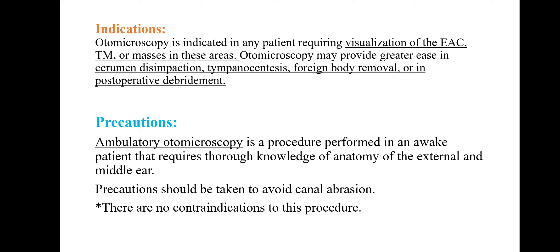Precautions: Ambulatory otomicroscopy is a procedure performed in awake patients that requires thorough knowledge of anatomy of the external and middle ear. Precautions should be taken to avoid canal abrasion. There are no contraindications to this procedure.